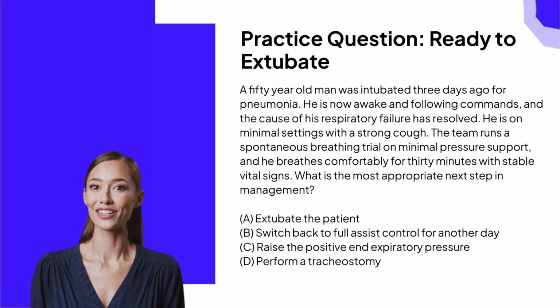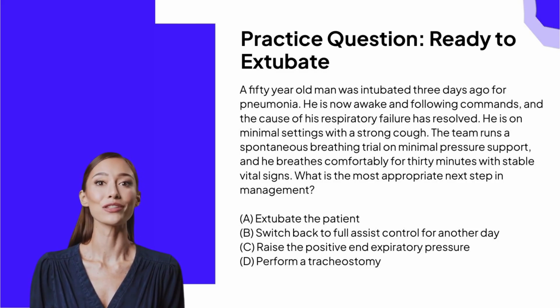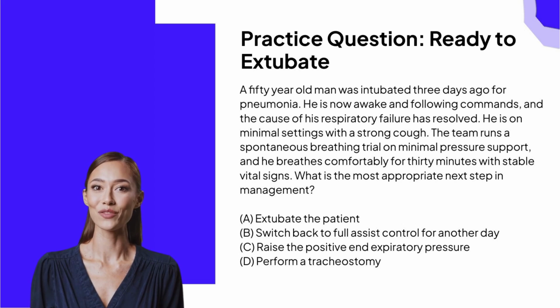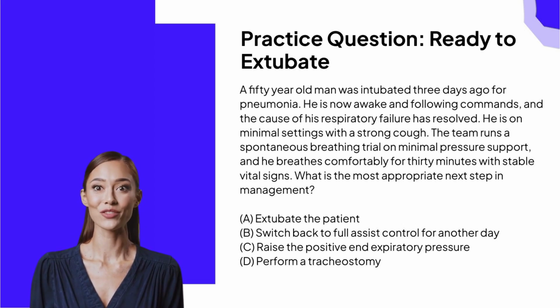That single habit will carry you through the majority of settings questions you see. Here is our third practice question, and it is all about recognizing readiness to come off the ventilator. A 50-year-old man was intubated 3 days ago for pneumonia. Now read the stem like a checklist, because the writers are handing you every readiness criterion on purpose.